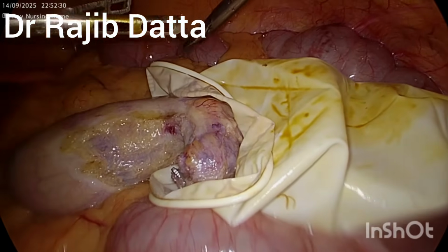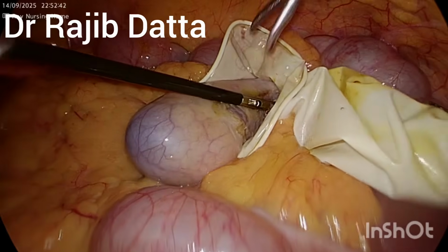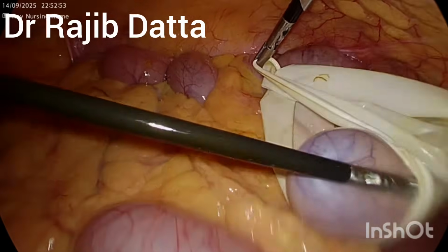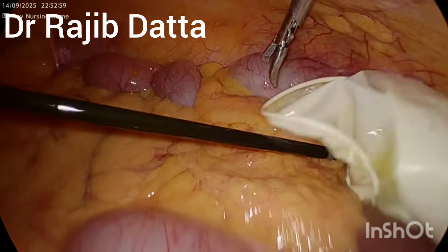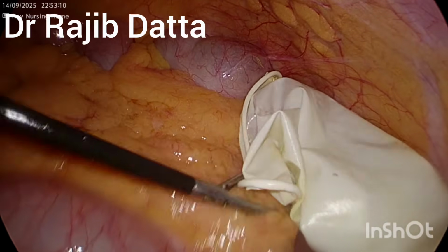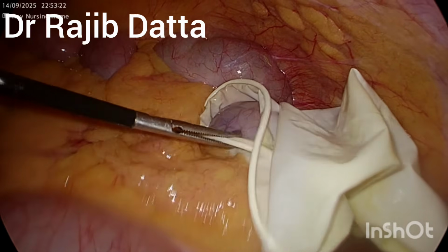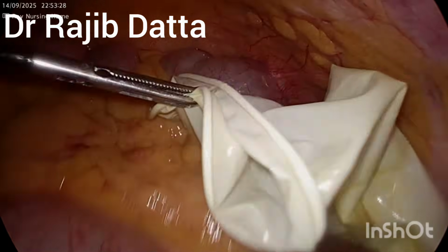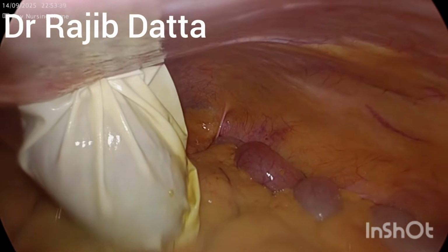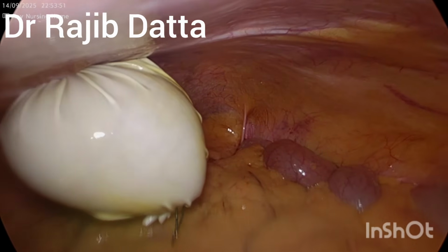and it is properly put into the glove endo bag so that none of the part will remain outside this endo bag. Entirely it is to be in. Now the gallbladder along with the endo bag has been extracted out with the abdominal, that is the umbilical port.